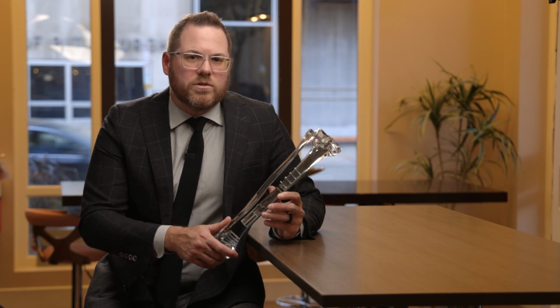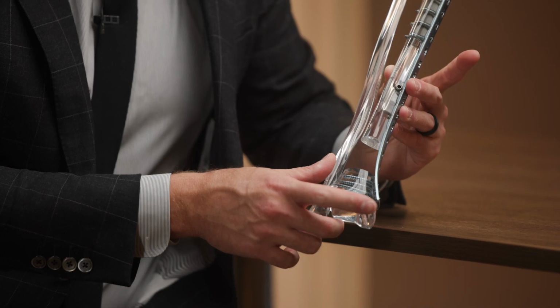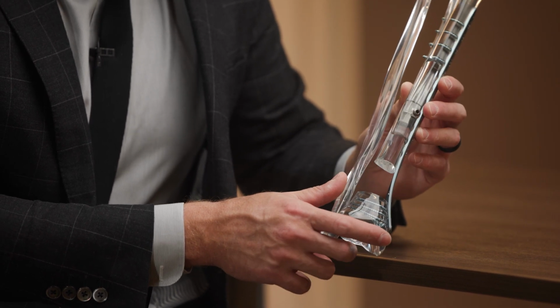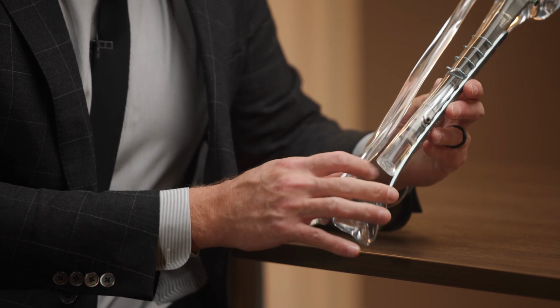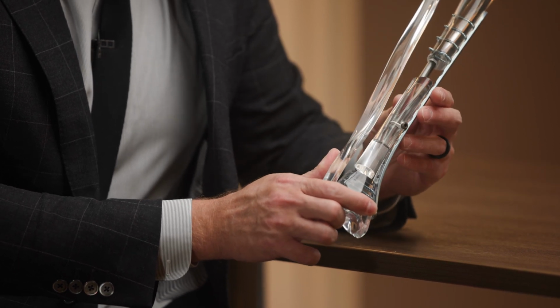When performing the PABST with antegrade push technique, it's important for the surgeon to achieve alignment of the tibia. In this case, we've used a plate. The plate is spanning the segment from distal to proximal, and it's critical to restore all parameters of alignment. Once this is done, we're using the intramedullary nail to guide the transport segment distally.